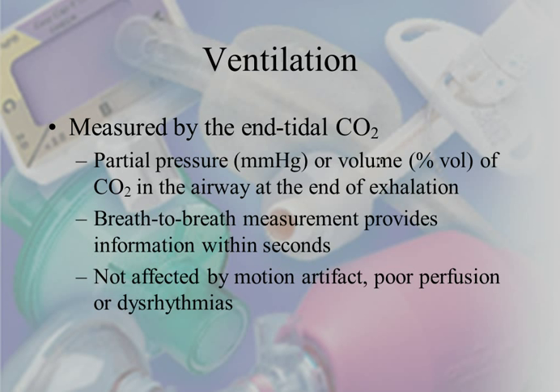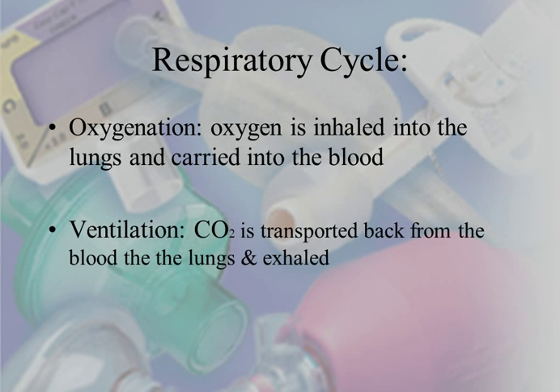Now, ventilation is measured by the end-tidal carbon dioxide. Partial pressure, so basically millimeters of mercury or volume of CO2 in the airway at the end of exhalation. It's a breath-to-breath measurement, which provides information within seconds. It doesn't matter if there's motion artifact, poor perfusion, or anything else. It's not affected by it. Once again, it actually tells you if you're perfusing or not, if you have a good perfusion, when you are studying the ventilation or the end-tidal CO2.